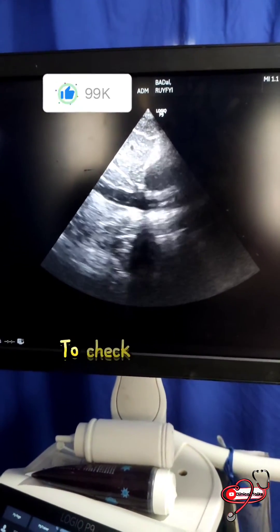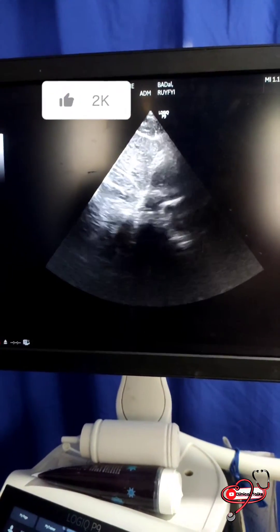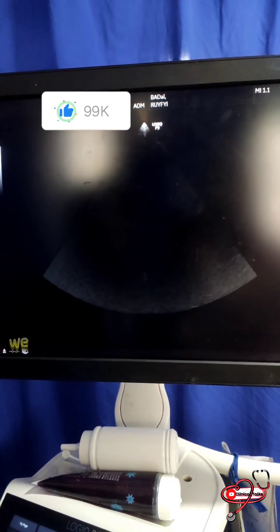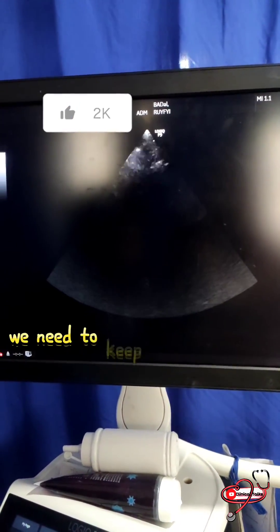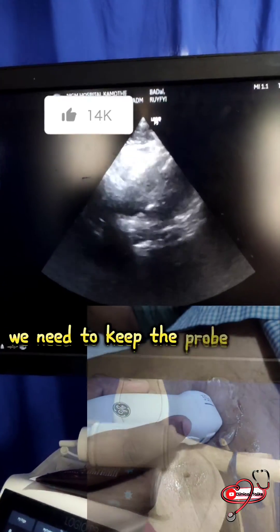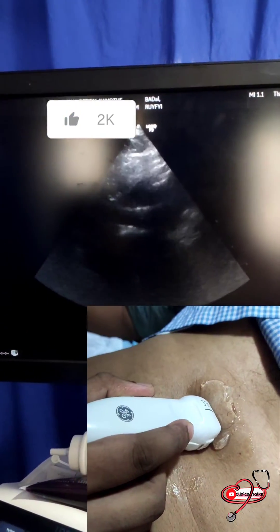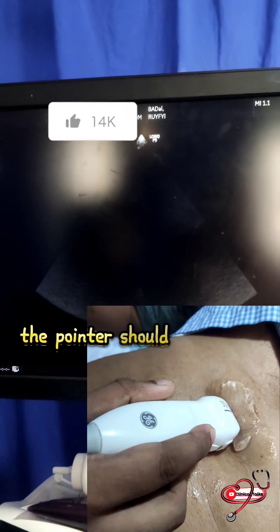To check the IVC, first we need to place the probe in the subxiphoid area with the pointer facing towards the left side of the patient.